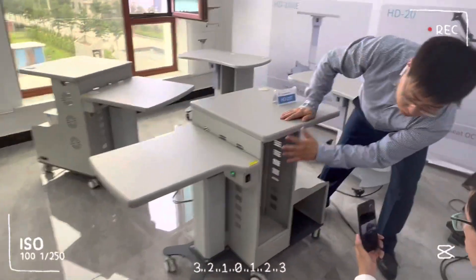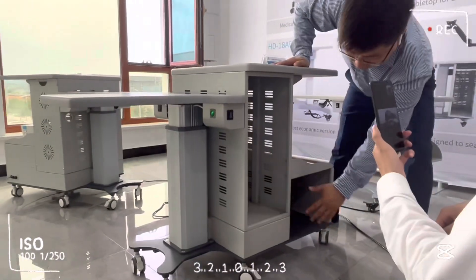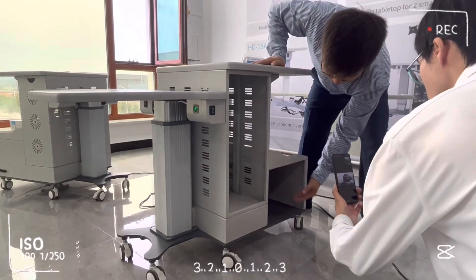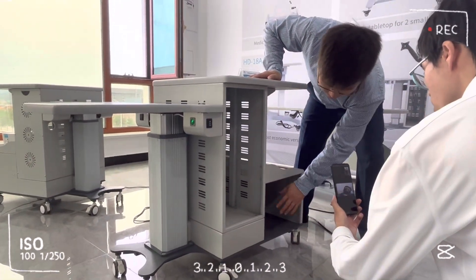This is for the lamp for the computer, and here is the start of the space, so you can put in the printing paper and other materials for storage.